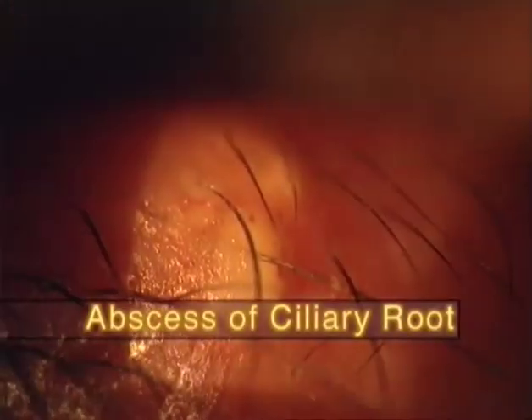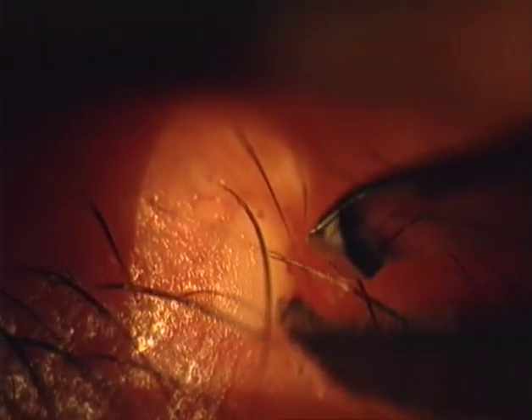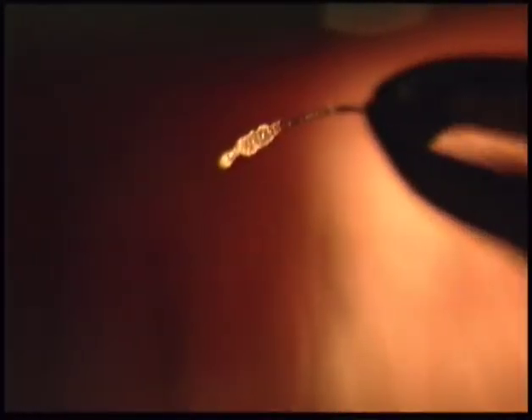In this next case, on the other hand, the purulent inflammation is localized at the lid skin and surrounds a cilium. When the cilium is removed, we recognize that the inflammation has also affected the ciliary root, because the bulb of the cilium has been destroyed. Just compare this with the root of a normal cilium.